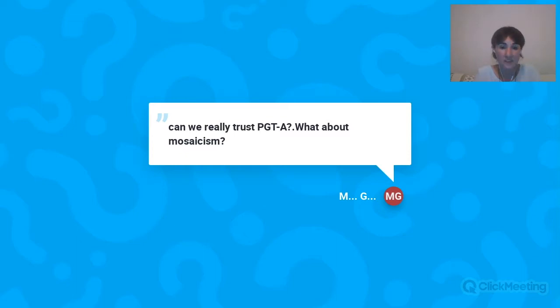This is a good question regarding the mosaicism. For example, sometimes we have results in patients of embryos who are normal, and other embryos are clearly abnormal. And we also have one result of PGS usage, which is mosaic. We have found different cells in the embryo. But depending on which chromosomes are affected, the mosaic embryos can be transferred, at least in our clinic.